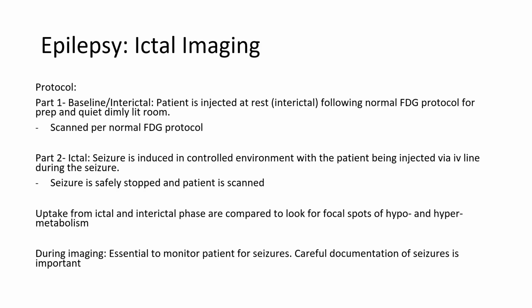During imaging, it is essential to monitor these patients for seizures. It's very important to carefully document any seizures that they had during the scan, before or after the scan. It is important to also stay with the patient, keep eyes on them the whole time, because the tables are very thin.